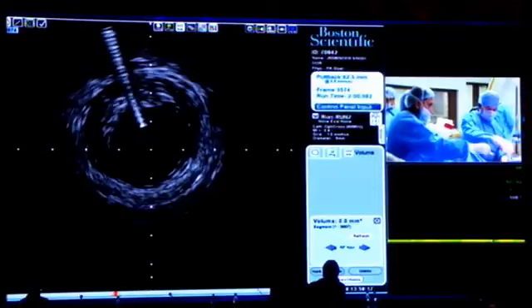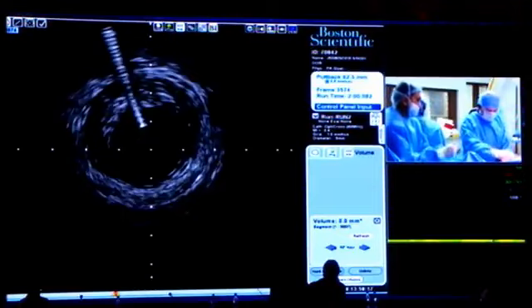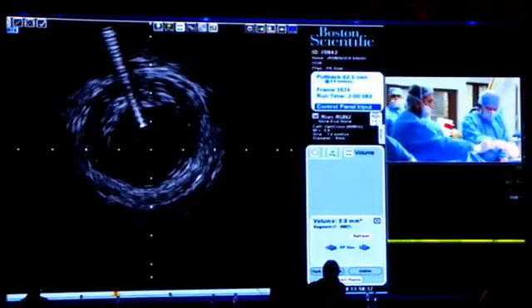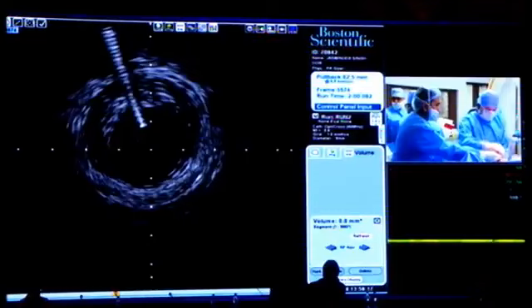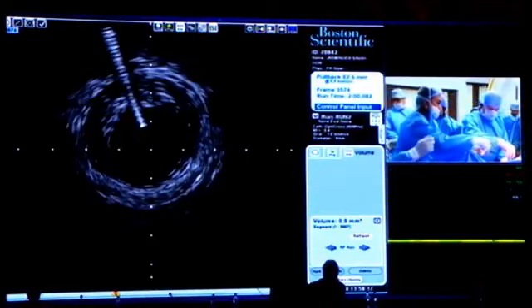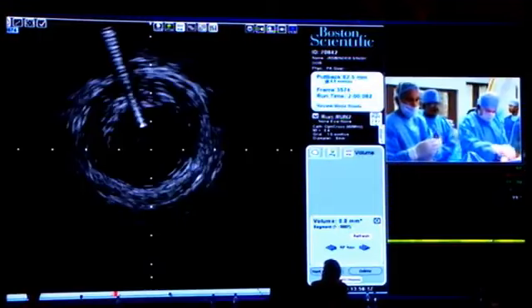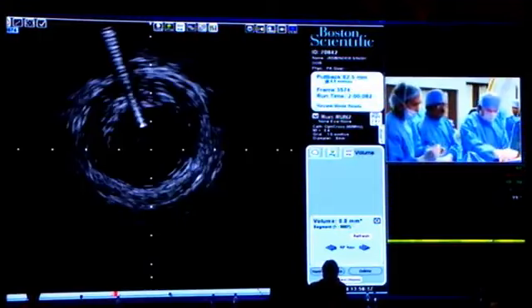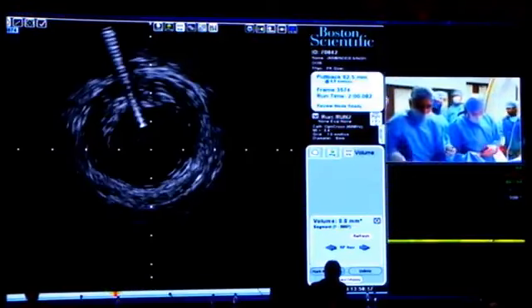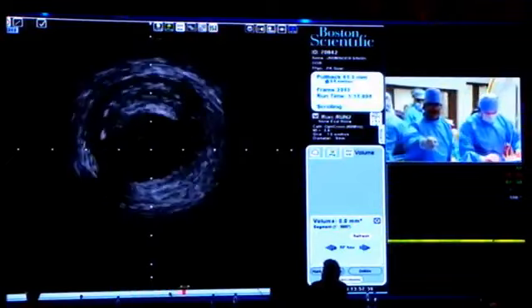Maybe we'll need 2 stents. At least 2 stents. Whichever. You can give me a Promus. Your plan is stenting from the PDA, crossover? Yes. Okay. You agree? Yes, I agree. So, can I move to Dr. Nagamatsu's room? We just review it once.